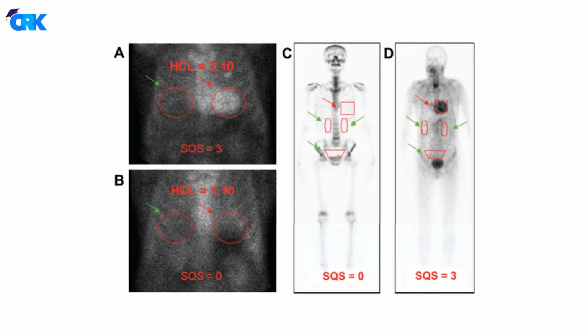Ultimately, quantitative methods like the H/CL ratio provide a reproducible and objective bridge between visual grading and advanced molecular imaging techniques such as PET. They not only enhance diagnostic precision, but also support consistent decision-making across imaging centers in clinical nuclear cardiology.